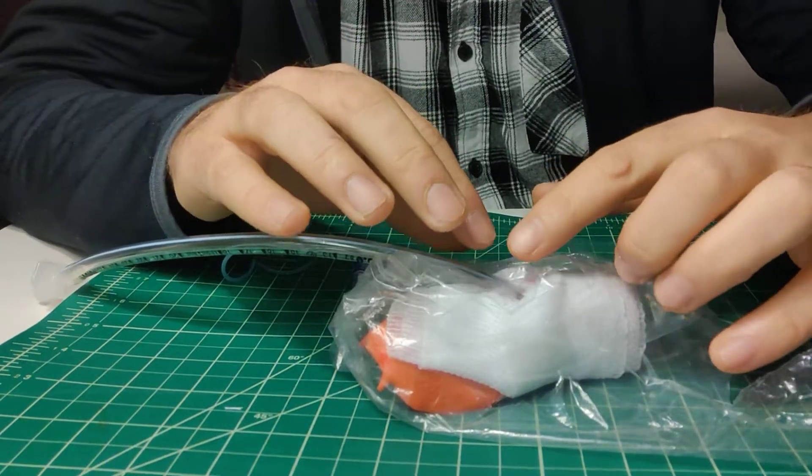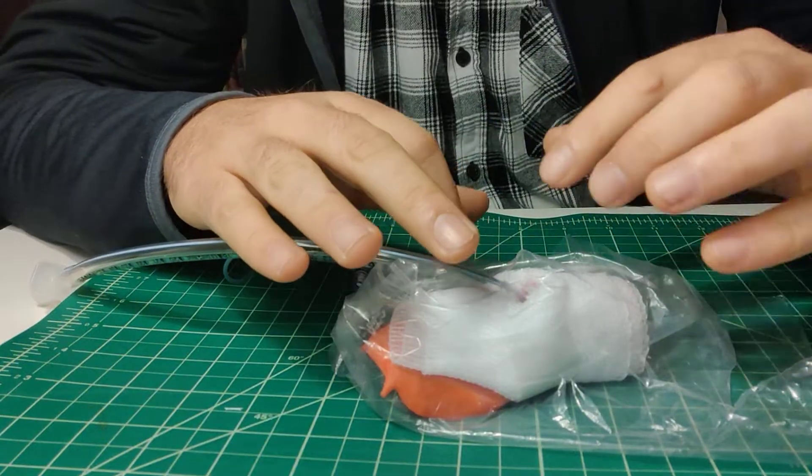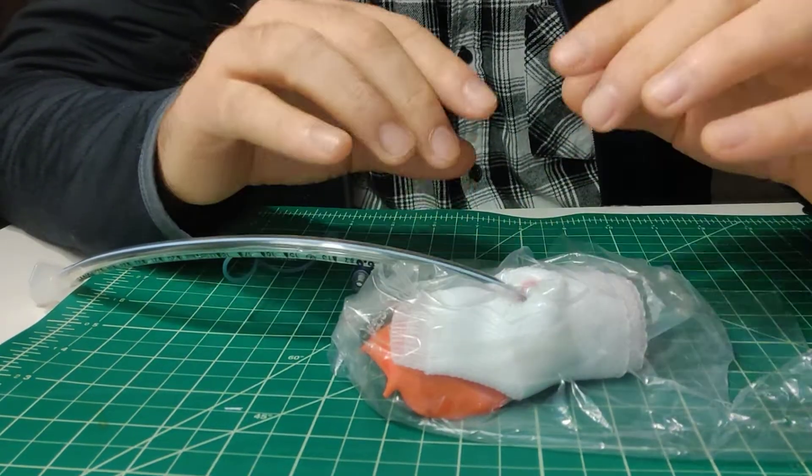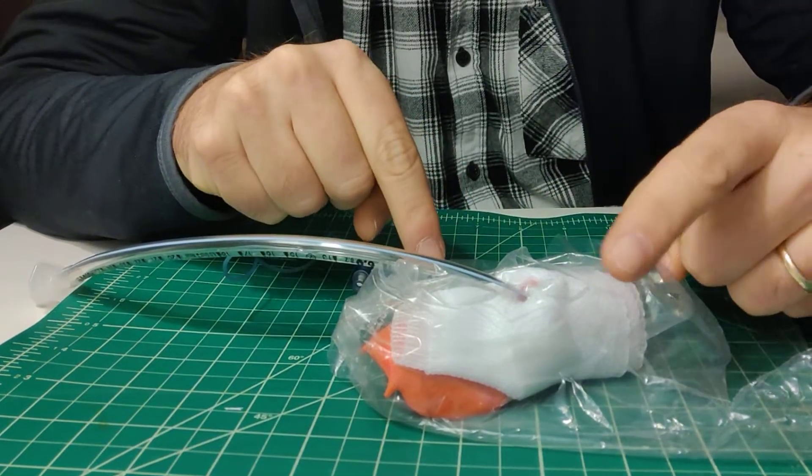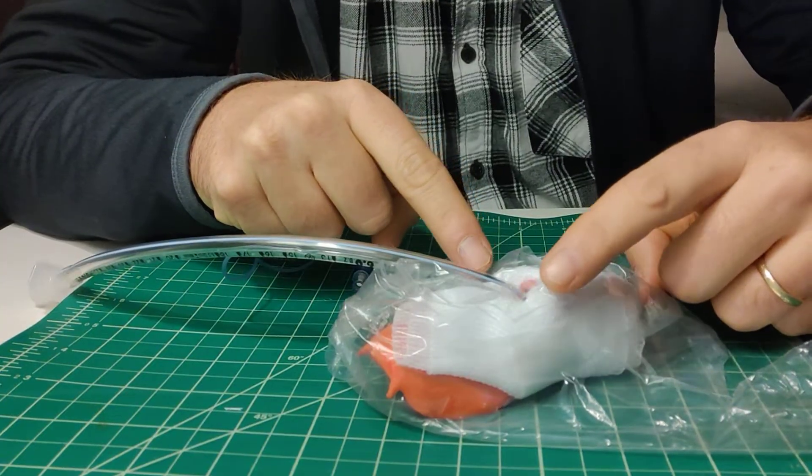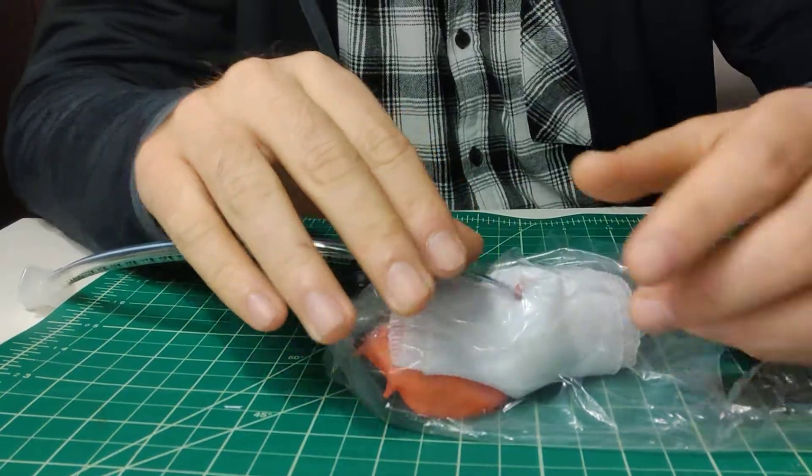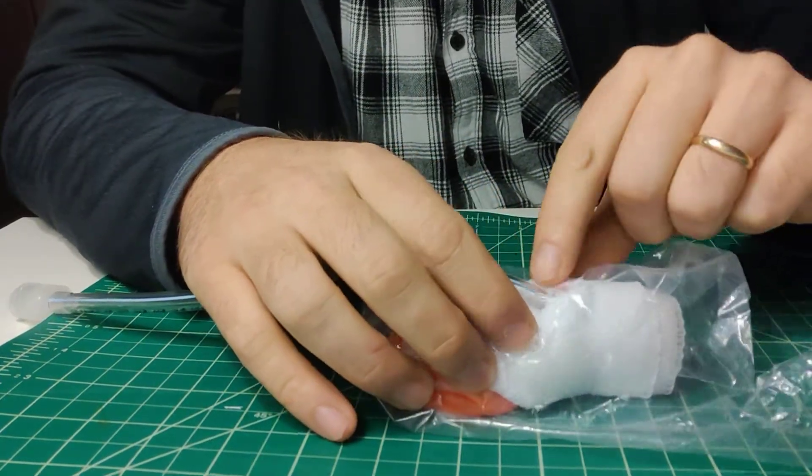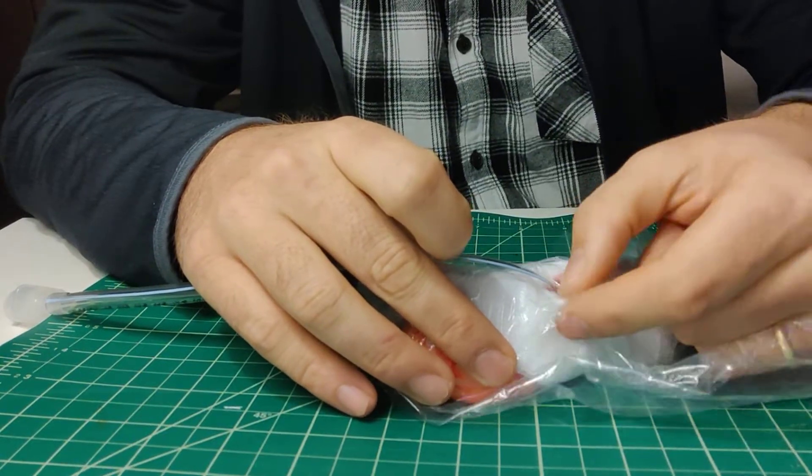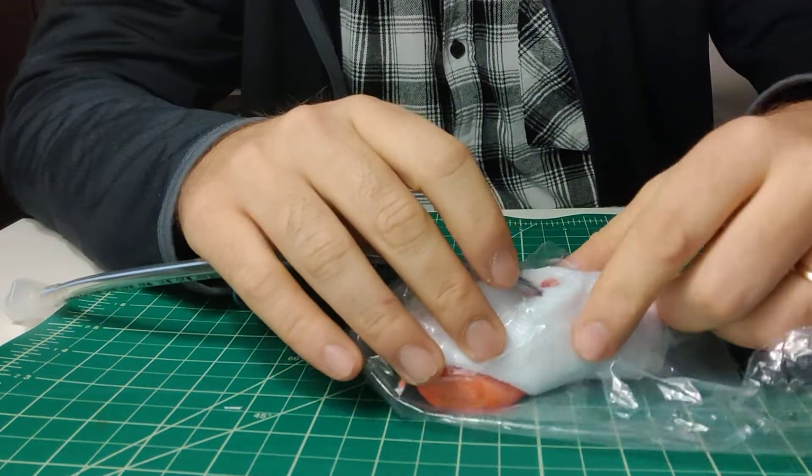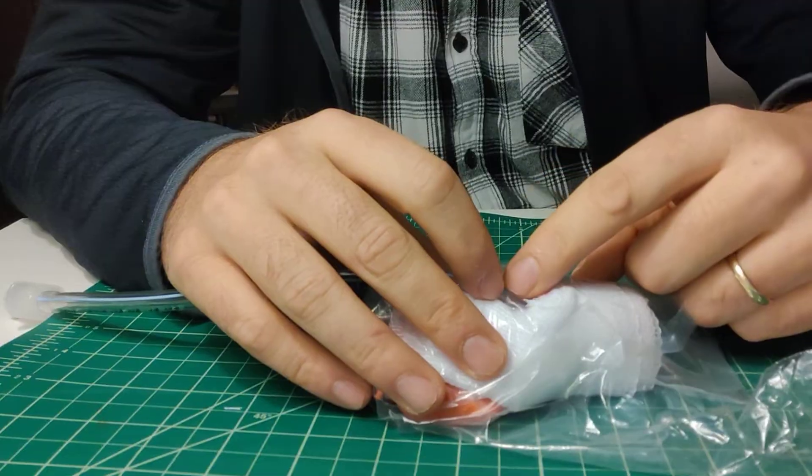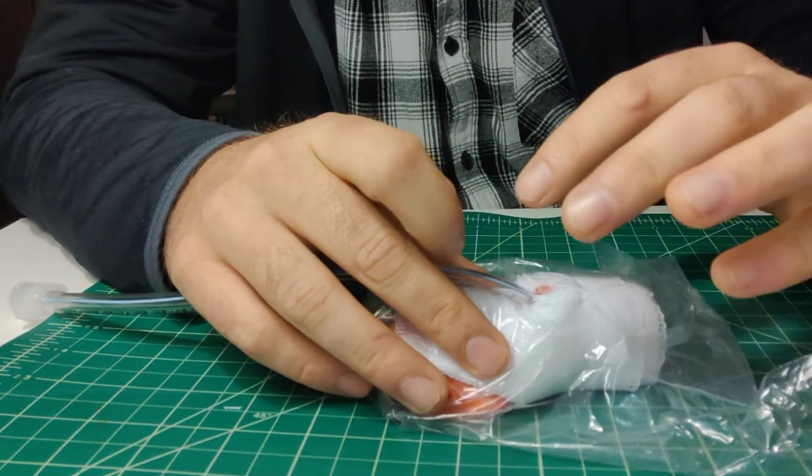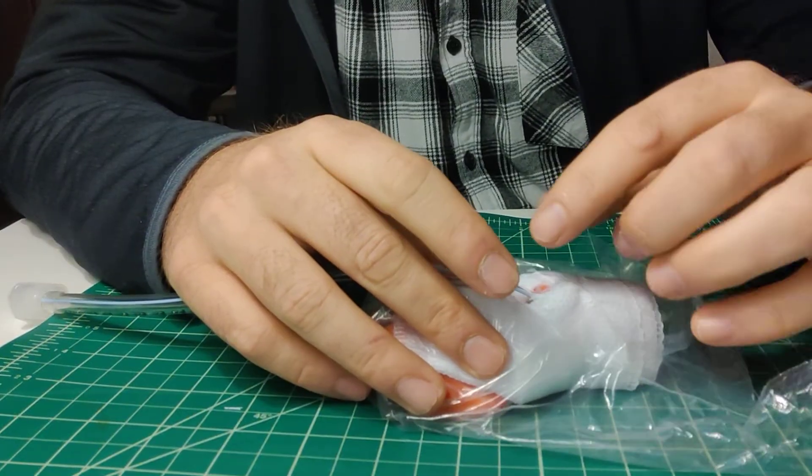The other thing is securing the airway. People try to tape these things, which might be fine. But in my experience, when I had to do these, it was with trauma. One was with trauma, one wasn't. But they both, I wasn't able with either of them, I wasn't able to secure tape to the airway one because it was a surgical site. The other one, because there was just a ton of blood everywhere. So what I would recommend is an added bonus to this is to learn how to suture the tube in place, kind of like a chest tube or something like that. Use two different points. It's easy to suture onto the four by fours here. And then wrap, do that tie like you do with a chest tube and that'll lock it in place. And it's especially important if you're thinking about transporting this patient, flying them out or something like that, or doing some kind of medevac. Or if you're not going to be in control of the airway, you're able to access it easily. I think it's a really good skill to practice.